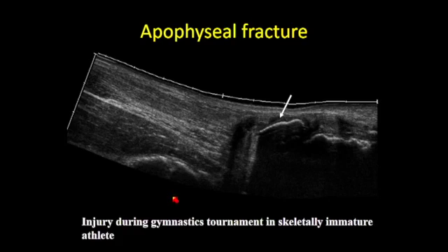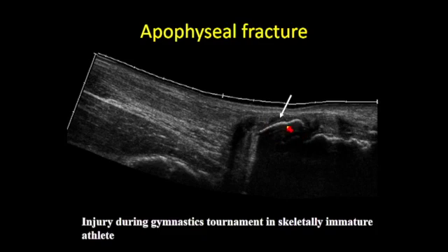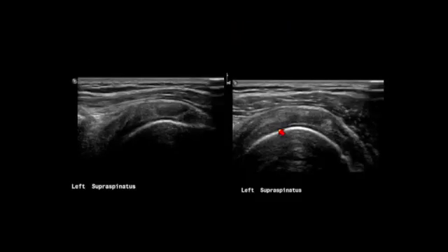Tendon tears also occur at sites of weakness. In children, the weak point is the growth plate rather than the tendon itself. In this high-level gymnast with acute retro-calcaneal pain during a floor exercise, the tendon remained intact but the apophysis was avulsed through the growth plate — the actual site of rupture. Additionally, tendon tears may be filled with complex soft tissue, granulation tissue, or scar tissue, making them difficult to visualize directly.